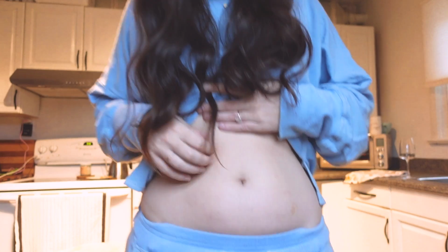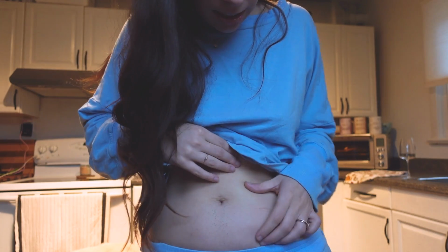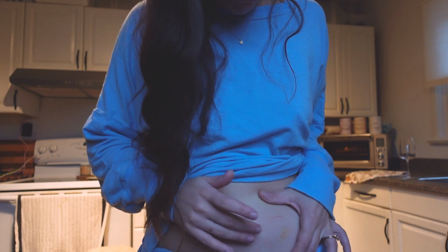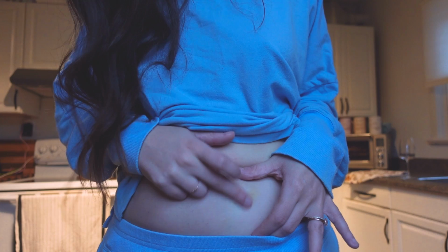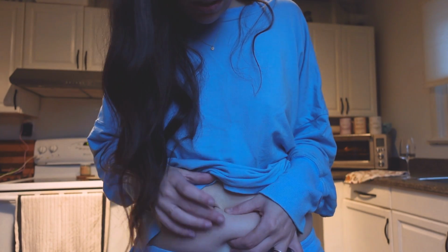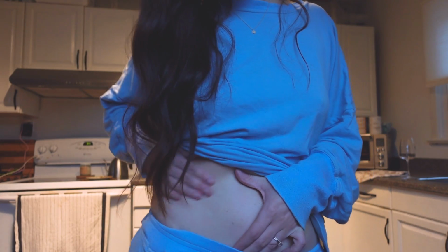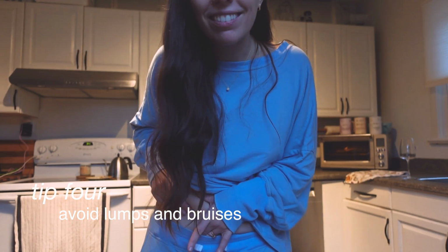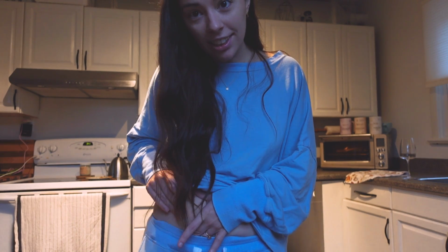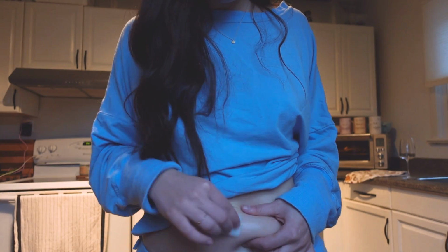Let's take a look at my stomach. Not too bruised. Looking pretty good. Okay, so I have to do it on this side today, but I have a big bruise here and a scratch apparently. So this is where I did the needle the other day and it's still sore. So maybe here's a good spot. Okay, the other option is not switching sides and doing this side again. So the next tip is just feeling around for where you're gonna put the injection, because you can feel the hard spots in your skin and you don't want to inject into those. Okay, I think I'm gonna switch sides like I'm supposed to and inject a little closer to the belly button.